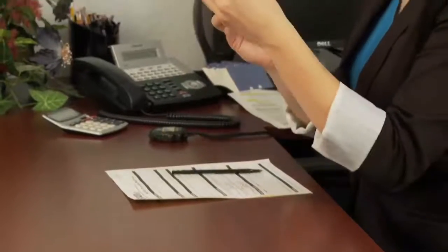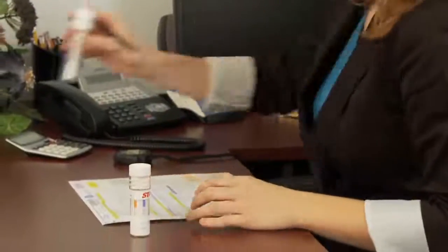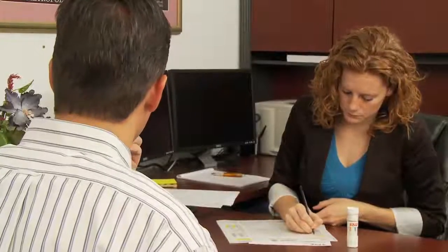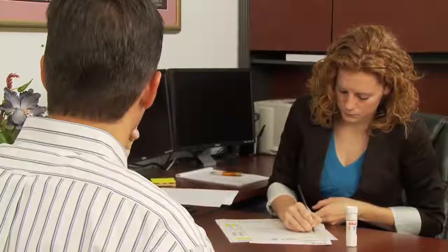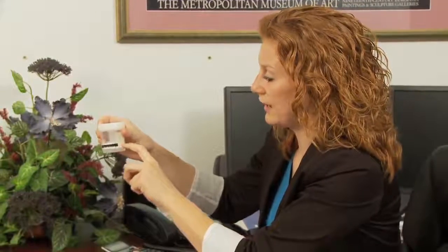If you elect to confirm using the STATSWAB device, then a second collection should be taken to ensure that enough oral fluid is available for testing. In this situation, use another STATSWAB collector cap, sponge, and collection chamber without test strips to send to the lab. An alternative confirmation test may be conducted with urine. Contact your service provider for further assistance.